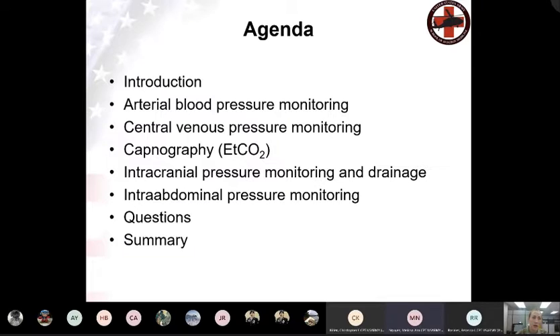So you mentioned getting a blood pressure. What's the benefit to doing invasive monitoring over, let's say, our standard blood pressure? It's slightly more accurate. It can be more accurate in an ART line that's functioning well with a good waveform. When you're doing a normal blood pressure, if there's any edema, dependent edema, or any edema within the arms, or the cuff's too big or too small, there's too many vibrations, or they're moving their arm, you can get a very inaccurate reading.